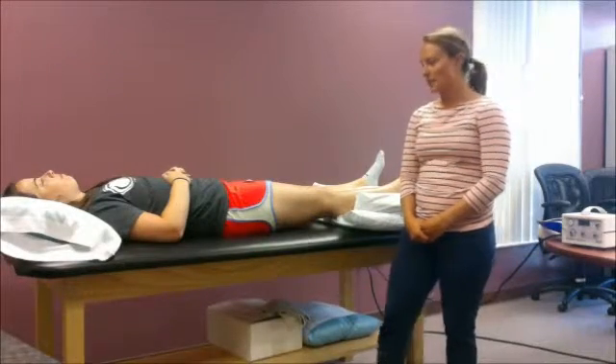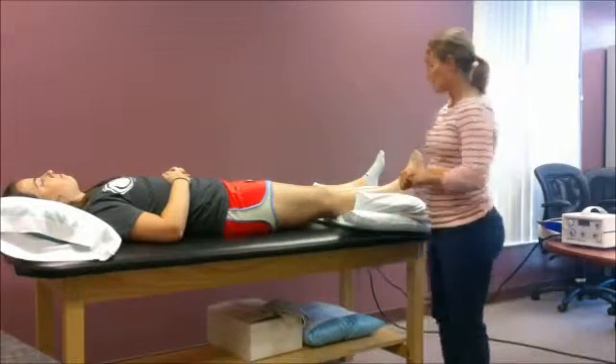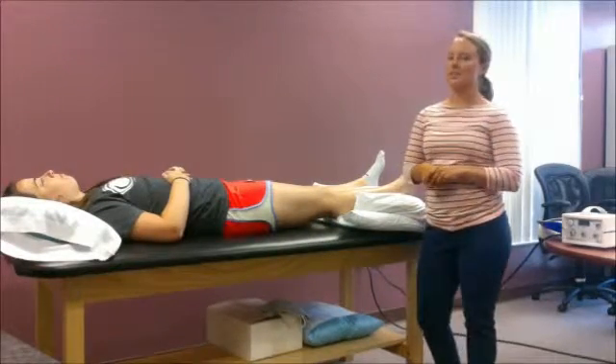Before we get started, I would hook her up to a blood pressure monitor so that I can monitor her blood pressure before, during, and after treatment. Also before, I'm going to check and make sure the ulcer is properly dressed.